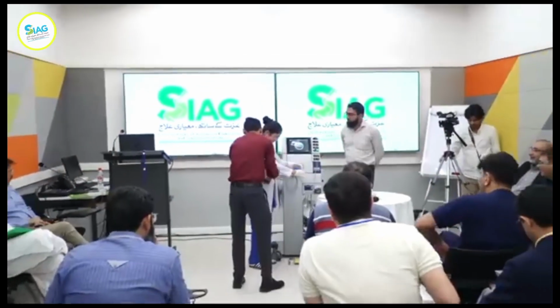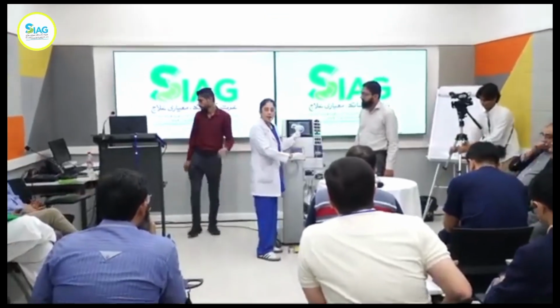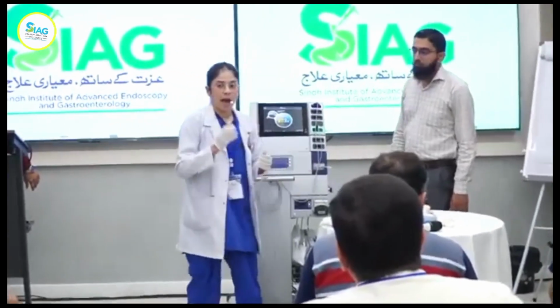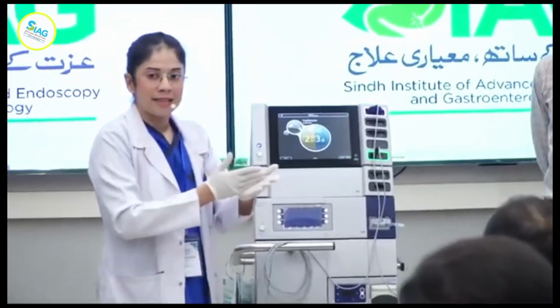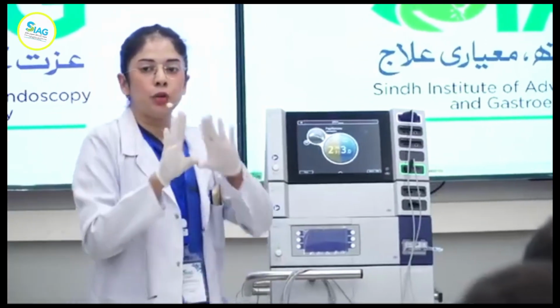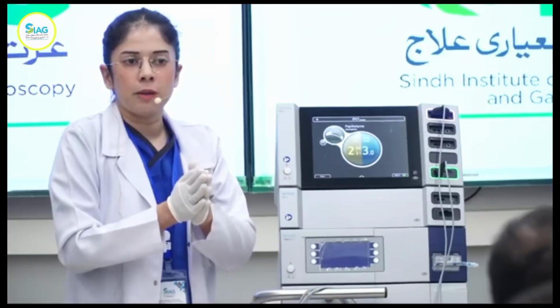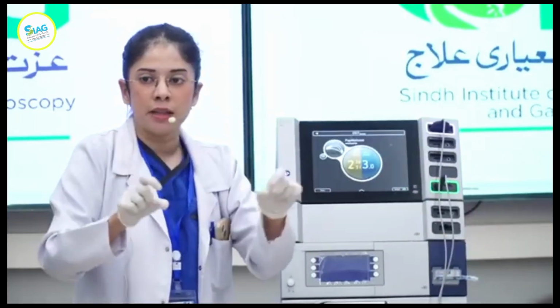Oh, I'm okay. So basically, you're looking at the effect here. 2 basically means effect. As Dr. Asim and Dr. Khalid mentioned, the effect is basically how much coag you're introducing into a cut. So pure cut means it's like a knife. You're slicing the tissue. You've seen it in sphincterotomy. Nice, clean, linear. You don't see much whitish tissue in the surrounding area. I think we saw sphincterotomy yesterday where the ampulla became quite white because the coagulation was high. That whiteness of the tissue is basically dehydrating the surrounding tissue, and that increases the resistance.